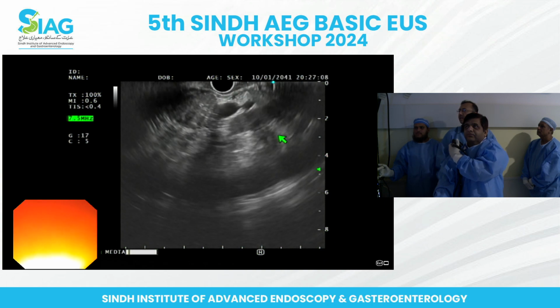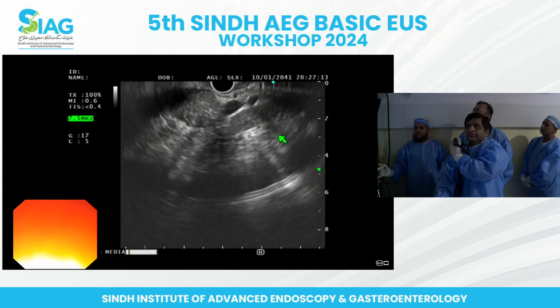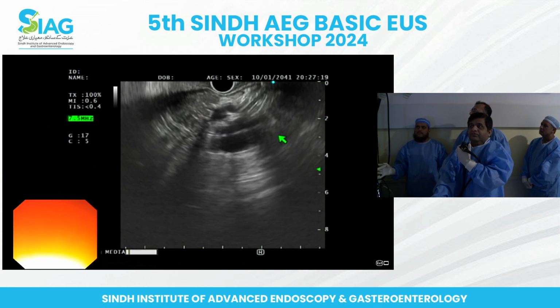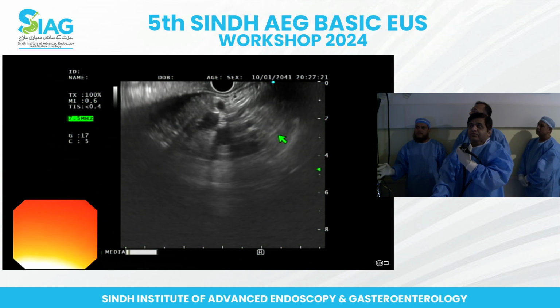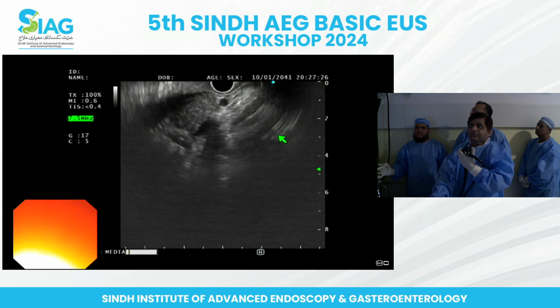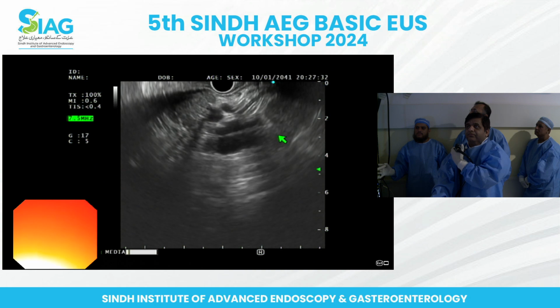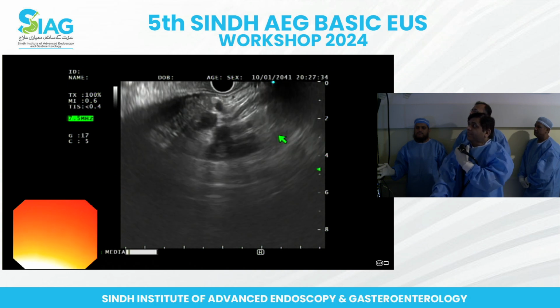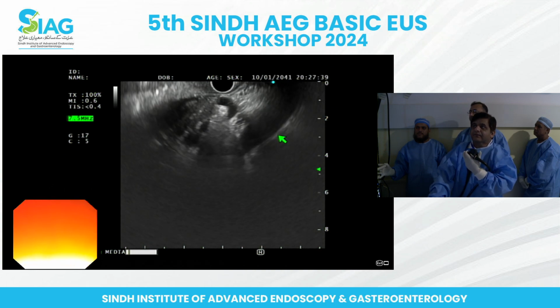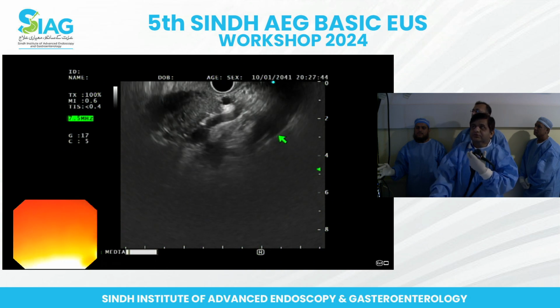Can you hear us, Professor Gas? Yes. So I just want to congratulate Dr. Shakir already, since compared to yesterday, there is less air, he's not putting air in, he's up against the gastric wall, and his movements have picked up some speed. So in the beginning of learning you are very slow, but as you get better at this, you start moving your shoulder faster. So I'll just encourage him to continue to move that left shoulder left and right, so that there is more movement, and then you just maintain your organ in view. Okay. Point well taken.